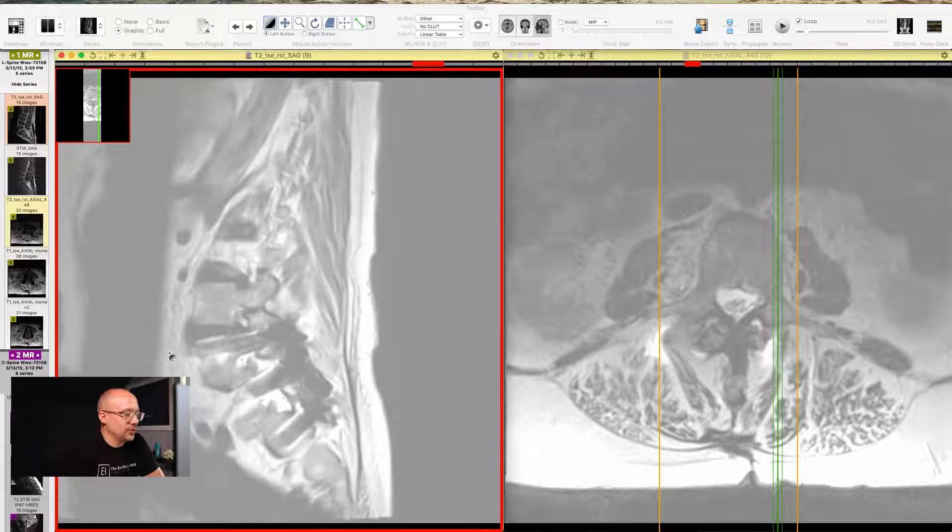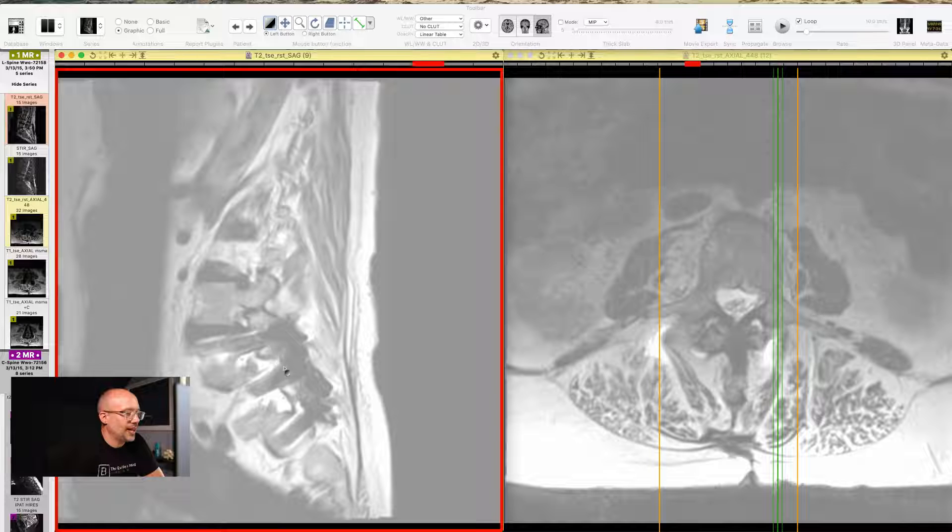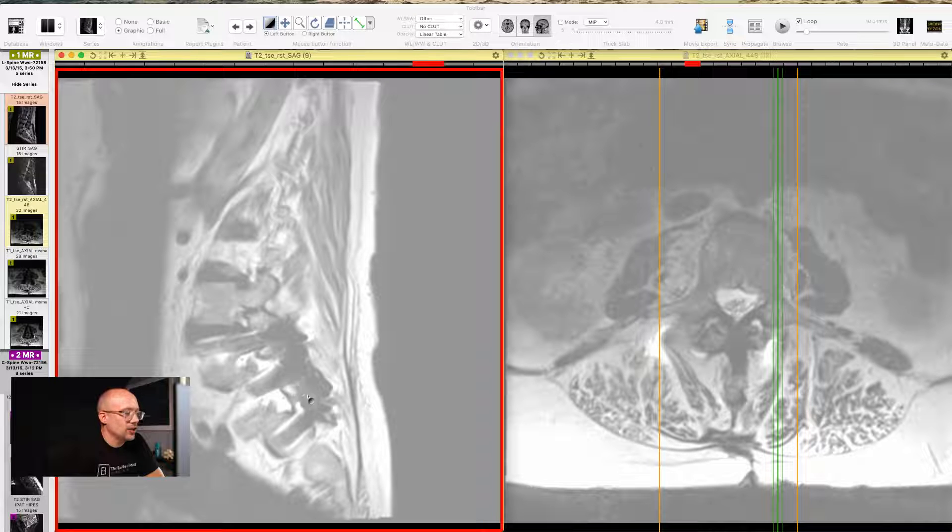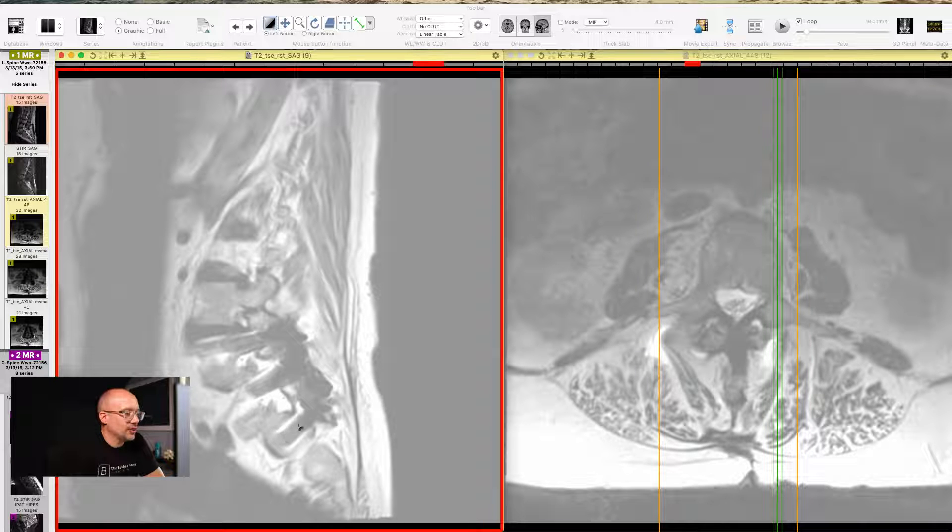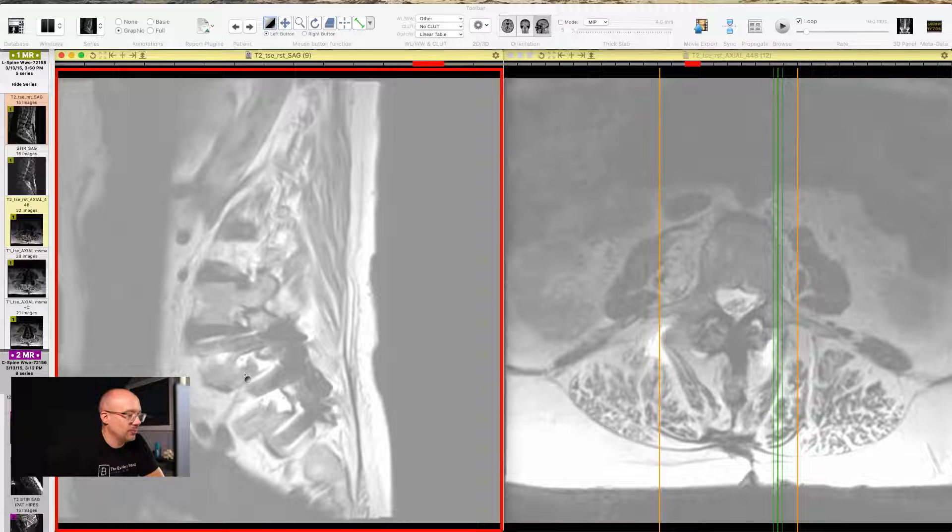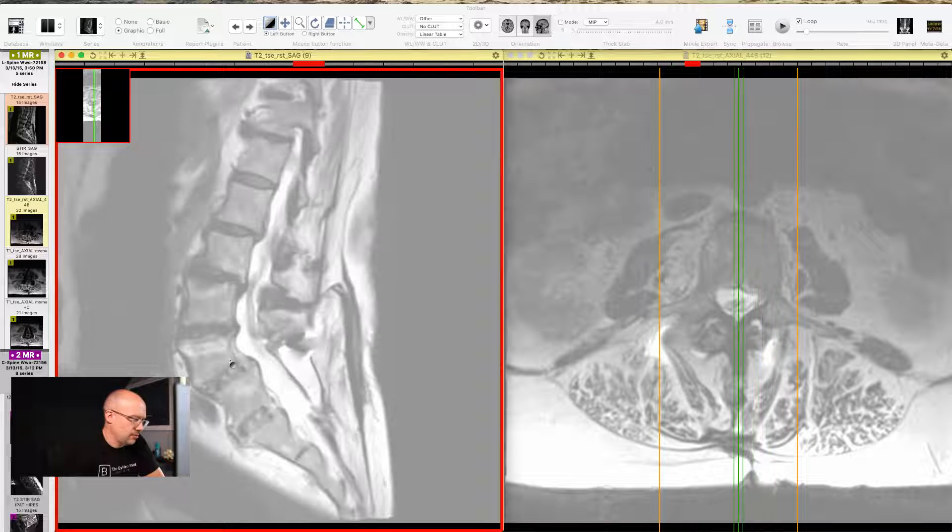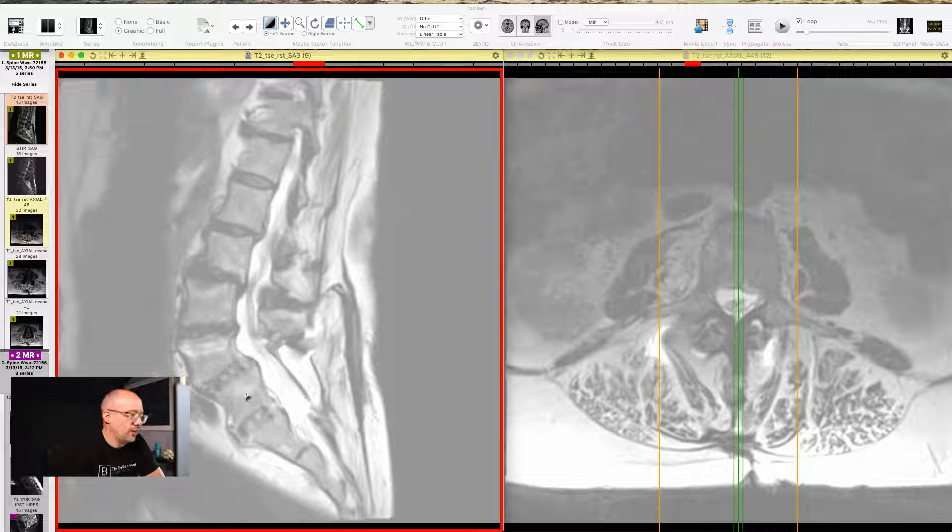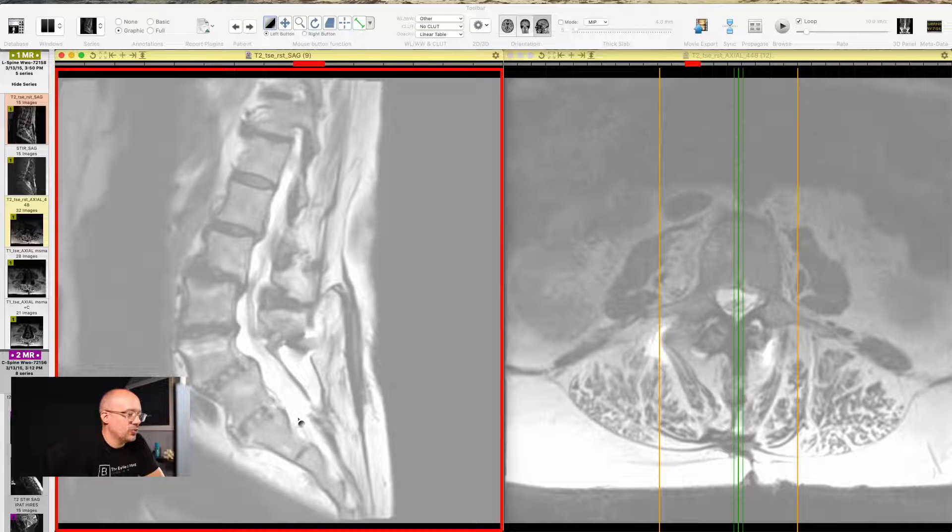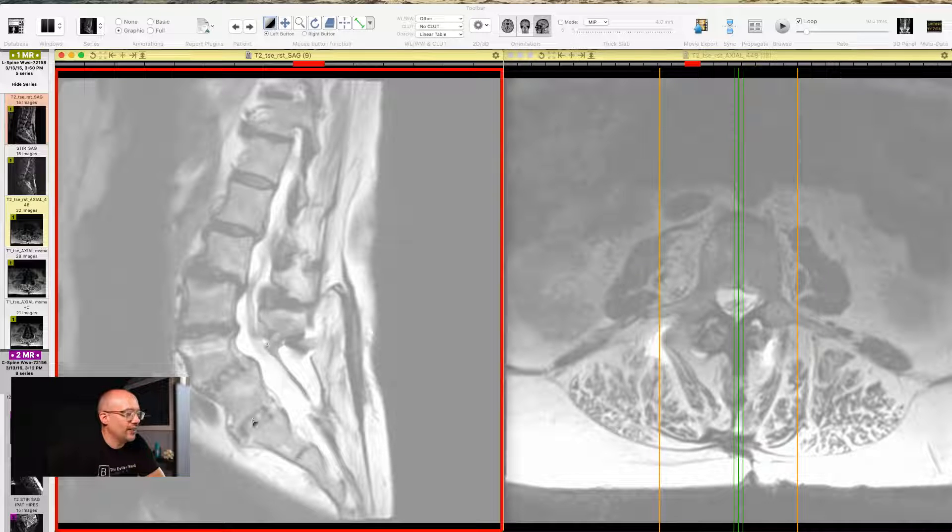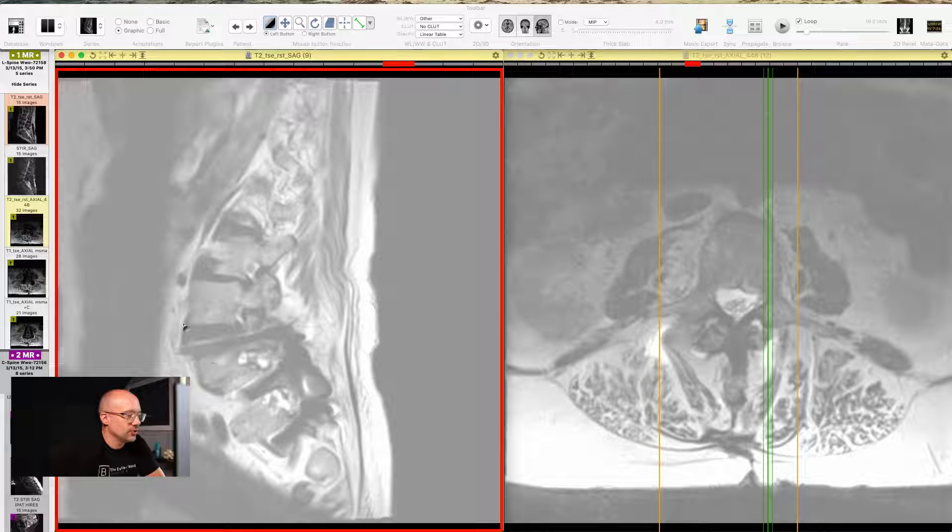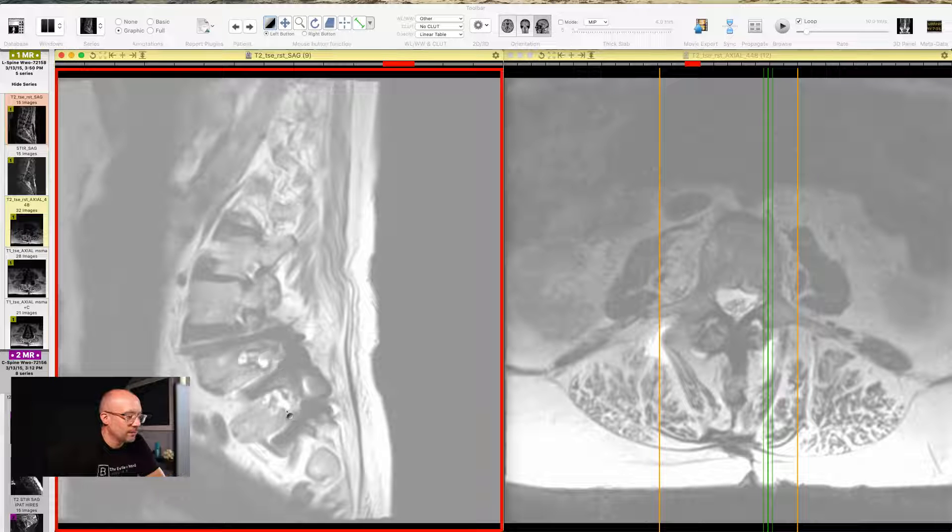Bam! You can see all of those rods and screws, these big black areas going in, those are rods and screws. That is a multi-level spinal fusion. I believe it's L4, L5, S1, multi-level spinal fusion. L4, 5, and 1 have all been fused. Look at that hardware going in.